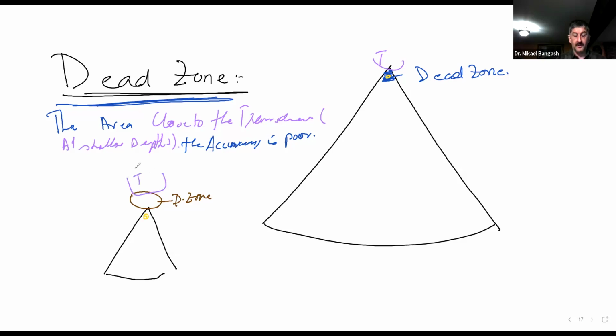This here now is your transducer. And what is it I may do? Mainly, use a bag with gel.